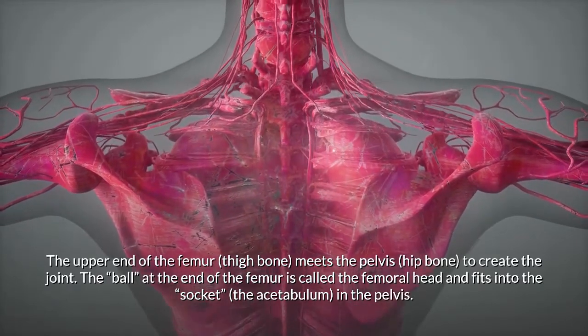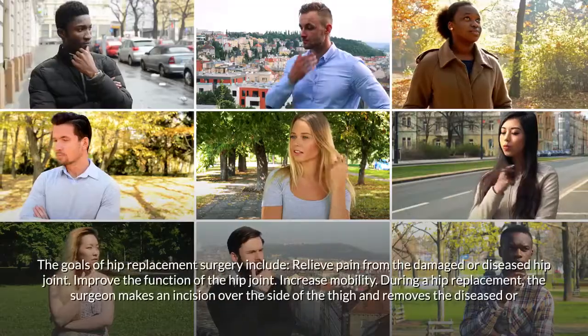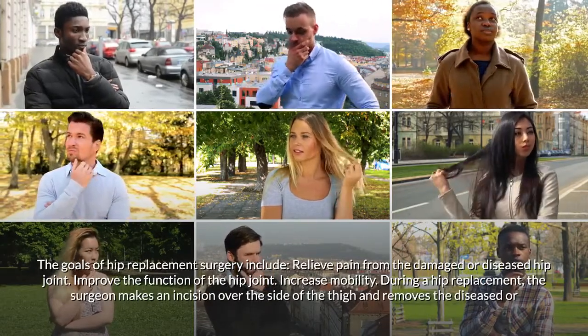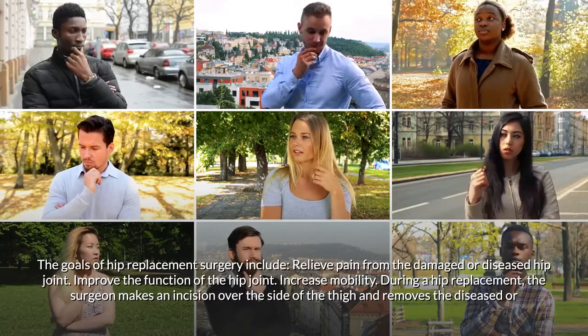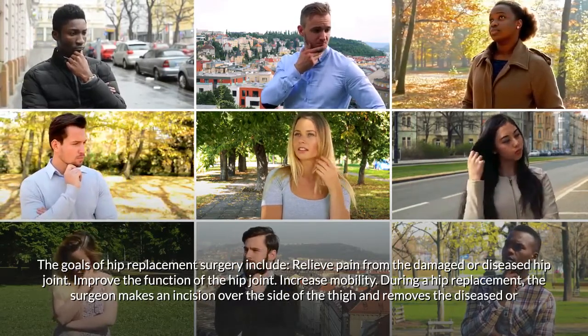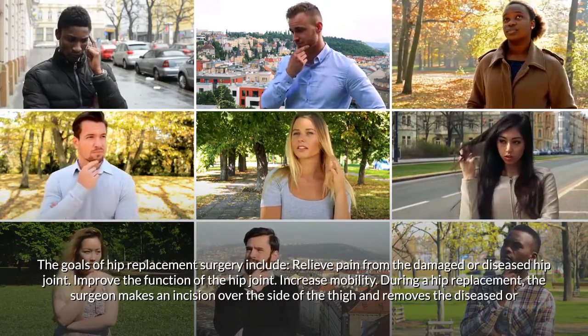The goals of hip replacement surgery include relieving pain from the damaged or diseased hip joint, improving the function of the hip joint, and increasing mobility. During a hip replacement, the surgeon makes an incision over the side of the thigh.